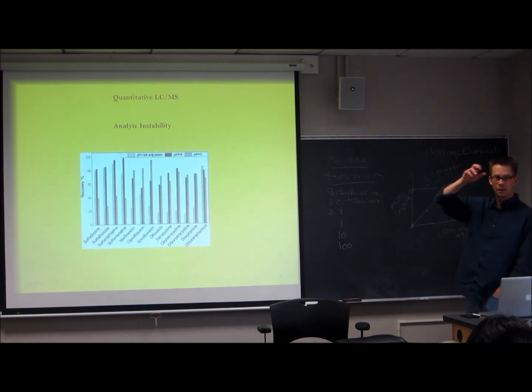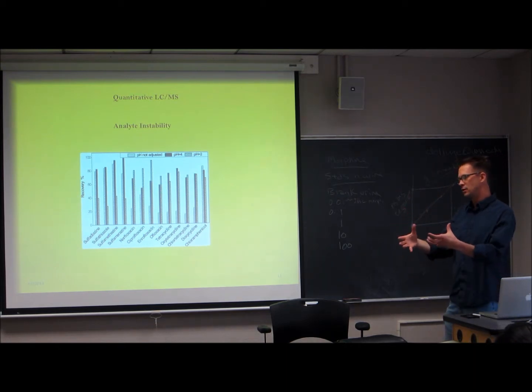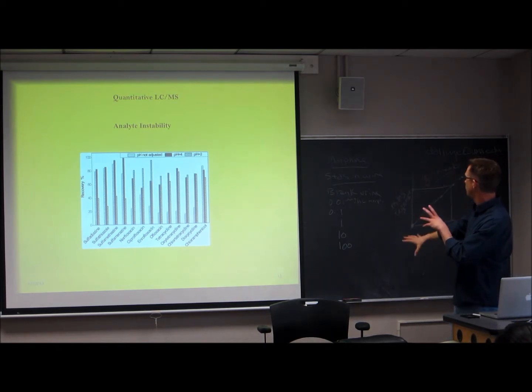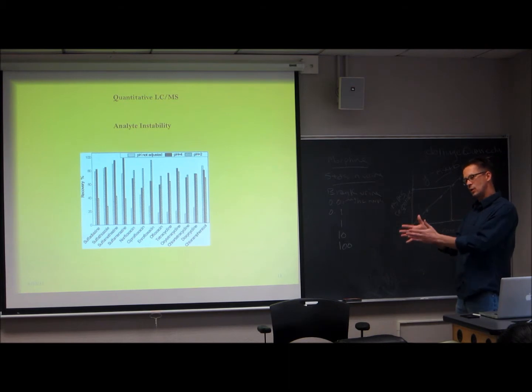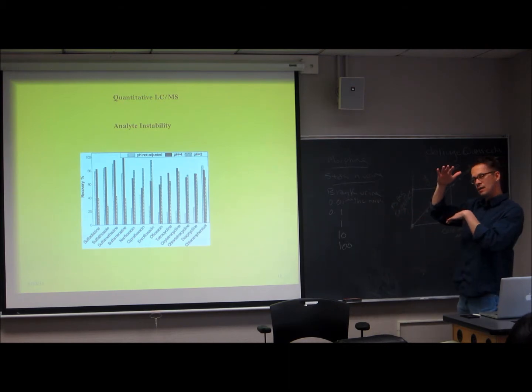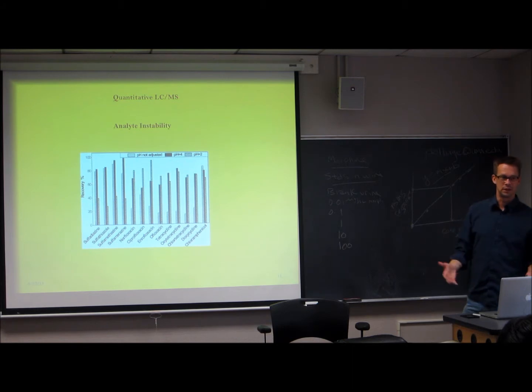Analyte instability. If you've got a compound and you make it up and you do an extraction and you've got your samples here, but over time in the autosampler for the LC-MS/MS, while these things are waiting to be analyzed in triplicate on the MS instrument, the analyte is starting to break down or hydrolyze. You're going to get an artificially low concentration for it because it's broken down.